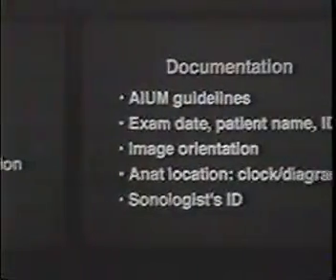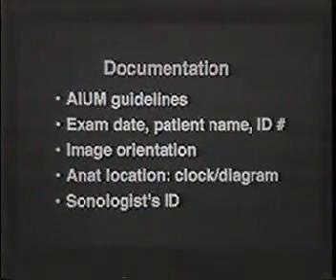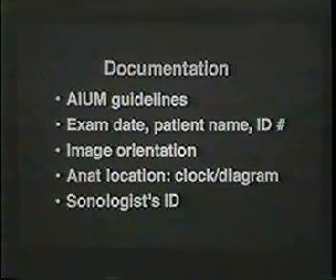In terms of the documentation of the images, according to the AIUM guidelines, which are consistent with the ACR guidelines from the Breast Task Force, each exam should include the examination date, patient's name and ID number, the image orientation, and the anatomic location based on a clock face and possibly a diagram.